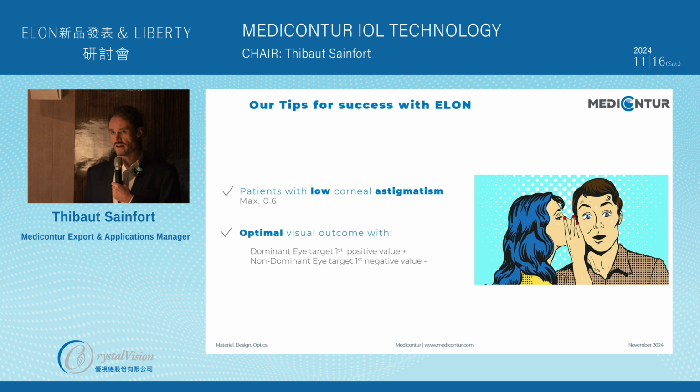Also, we optimize the outcome on the dominant eye by targeting the first positive value, whereas on the non-dominant eye, you can target the first negative value. Like this, you will create a little bit of depth of focus, and you will optimize the results and patient satisfaction.